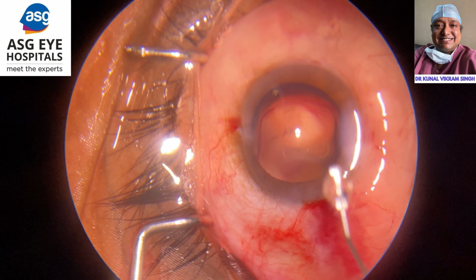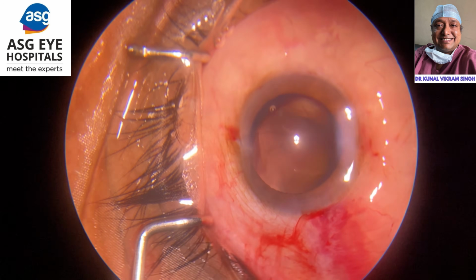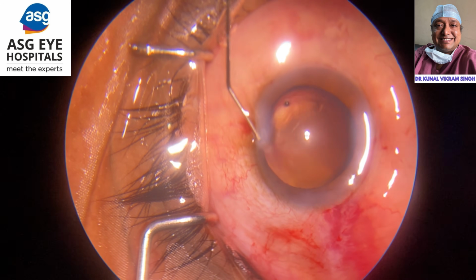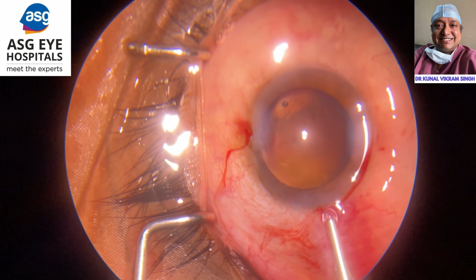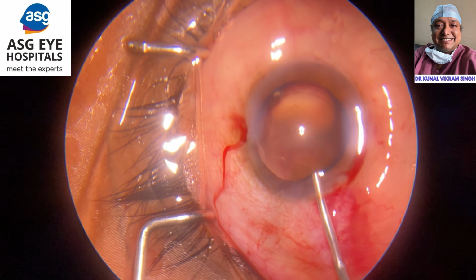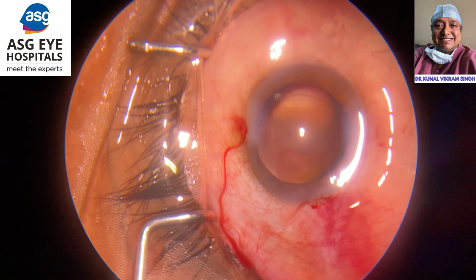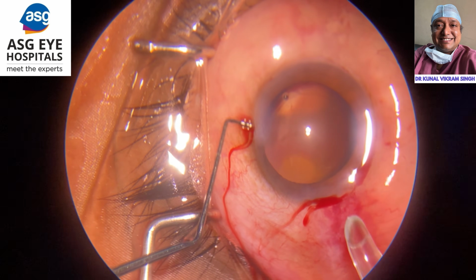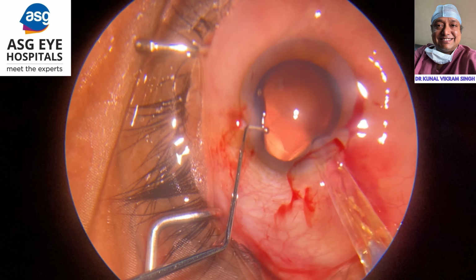I also thought that visco might be leaking from the side ports at times because of the fraying of the wound from the IA cannula. That can happen. So I hydrated that as well, refilled the AC with visco, and then tried to implant the IOL in the bag.